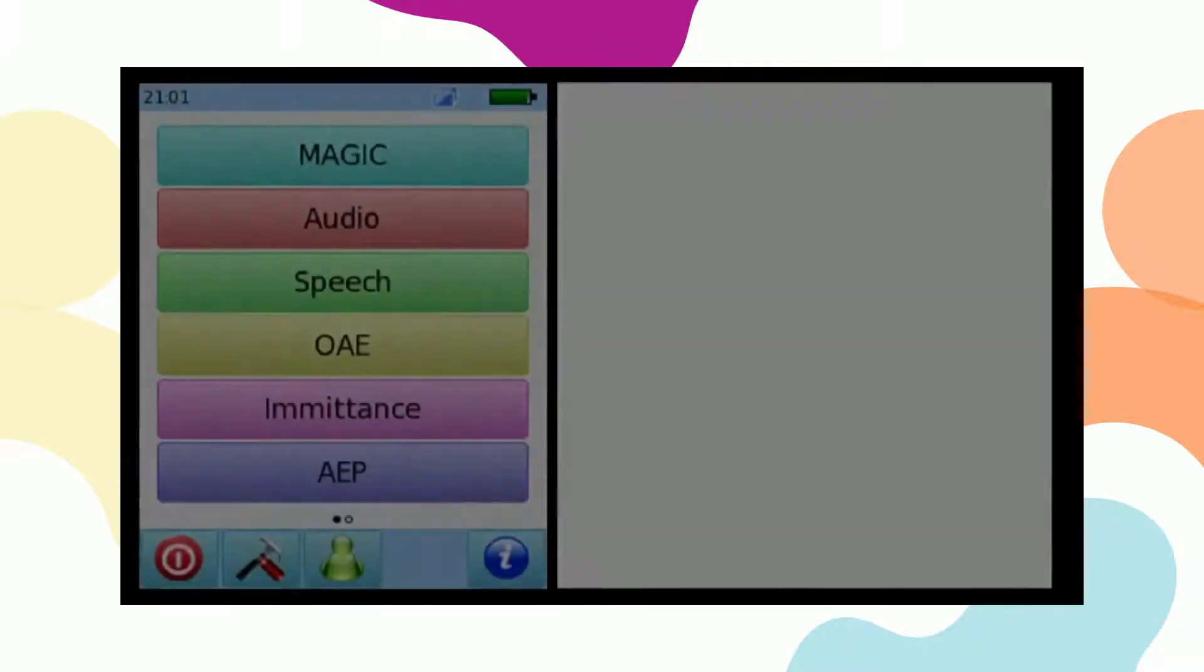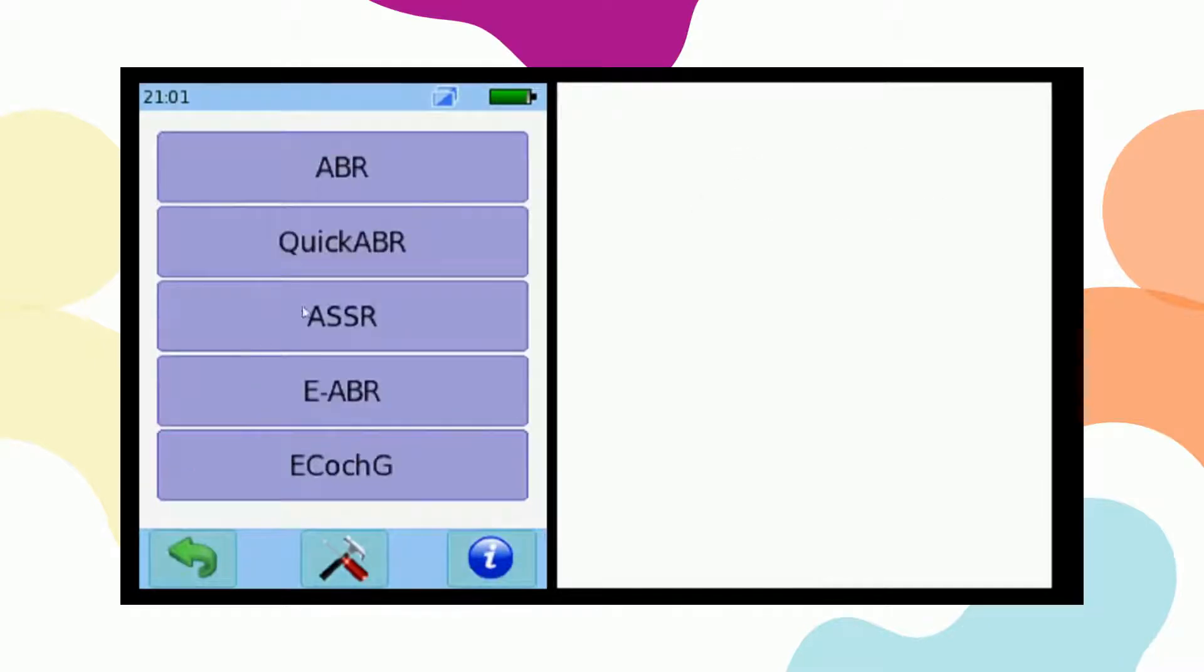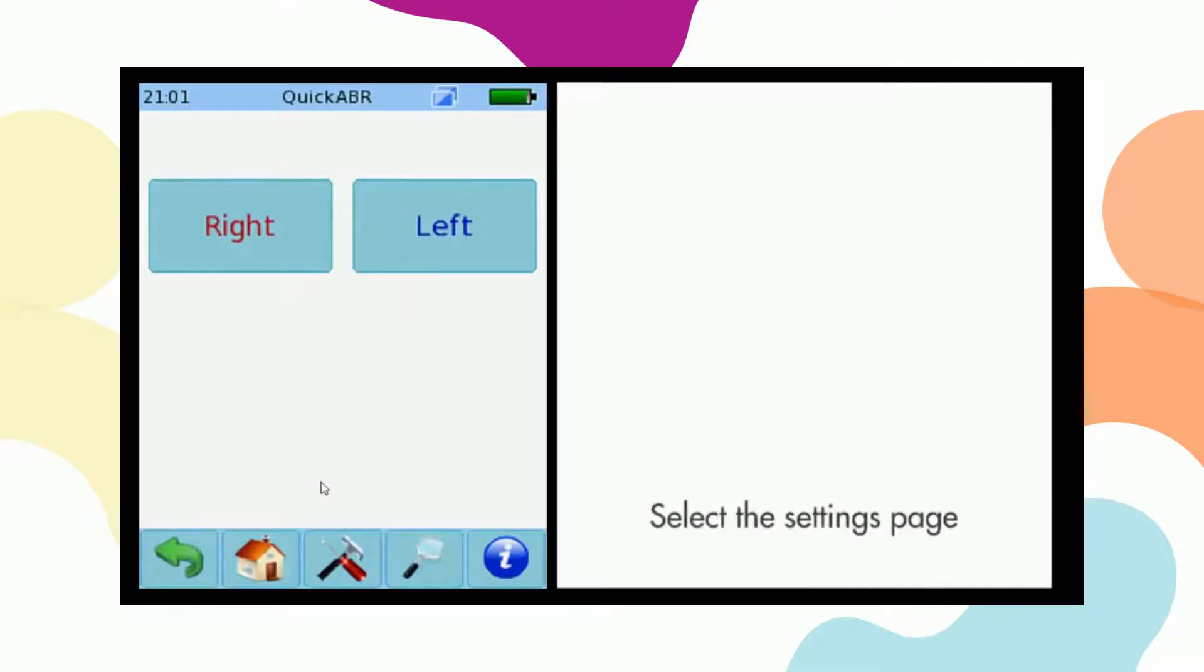From the main test screen select AEP, followed by Quick ABR. And now to the settings page.